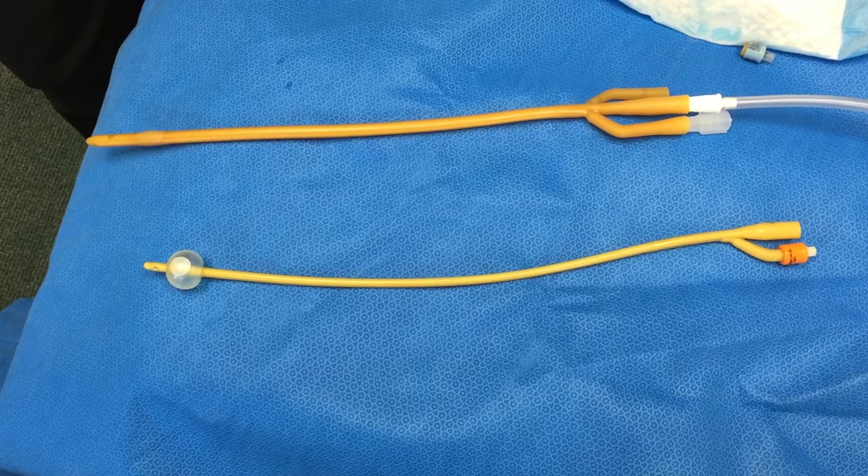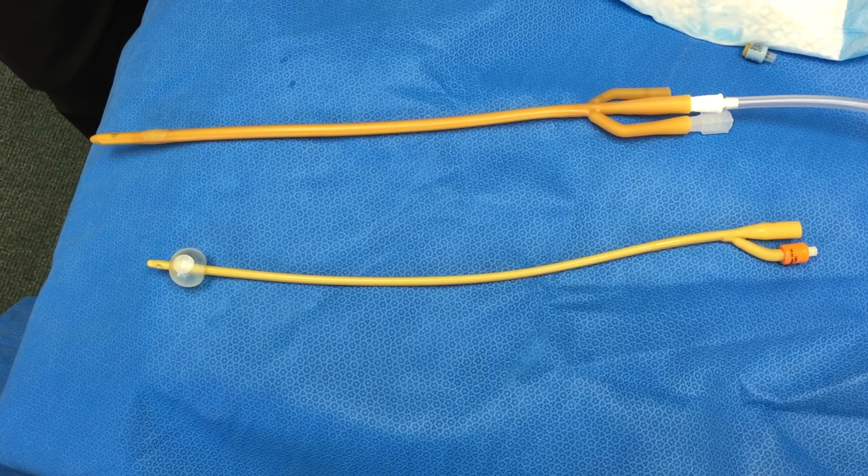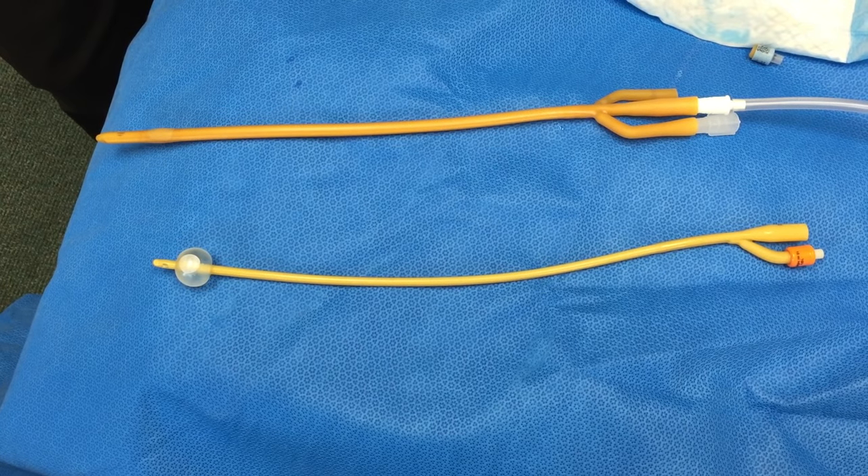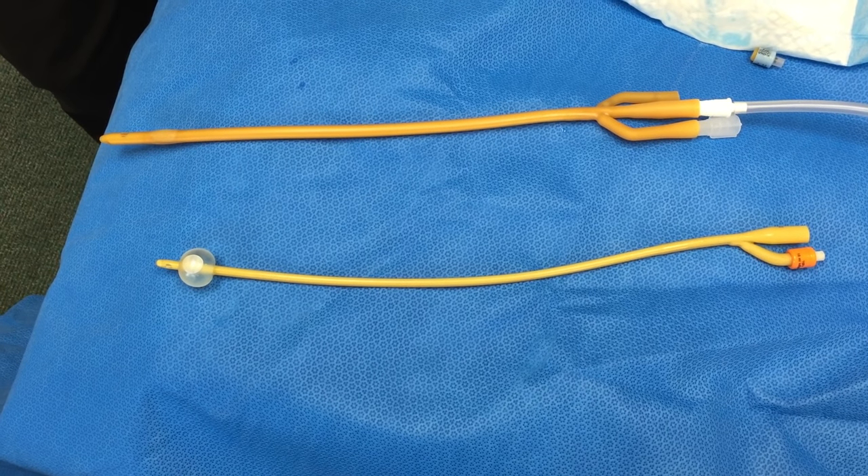You'll wait about 30 to 60 seconds until the sterile water stops leaking out. At that point, you should effortlessly be able to pull the catheter out of your body.